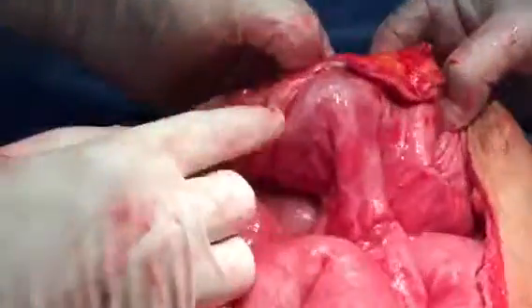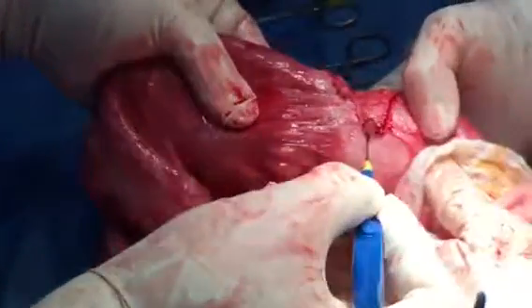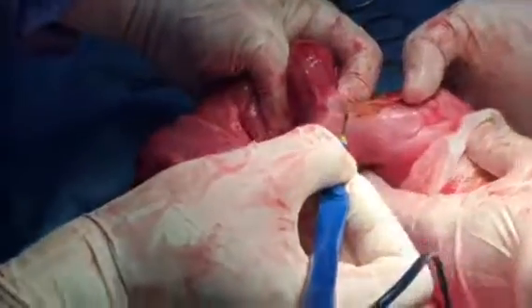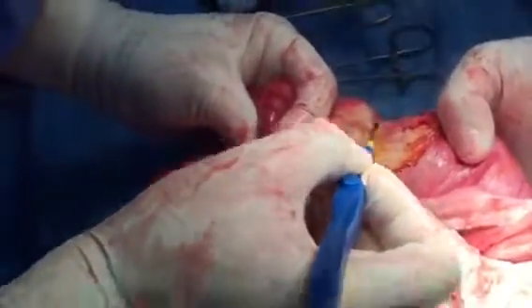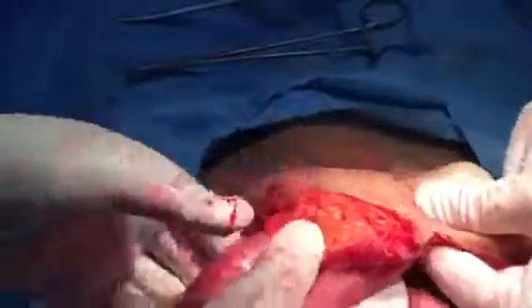Any other attempt is wrong because you will definitely perforate the bowel. The adhesion is well organized with fibrosis — there is no plane of dissection between them. It is not fibrinous, not a recently organized one to be separated by fingers, finger fracture, or pinching as usually used for small bowel adhesions. Now you can see how I am moving around the adherent loop and passing through the abdominal wall layers — this is how to remove this loop and put it inside the abdominal cavity.